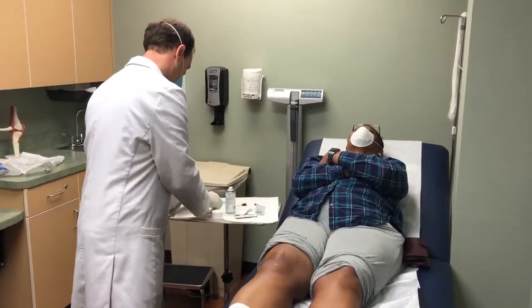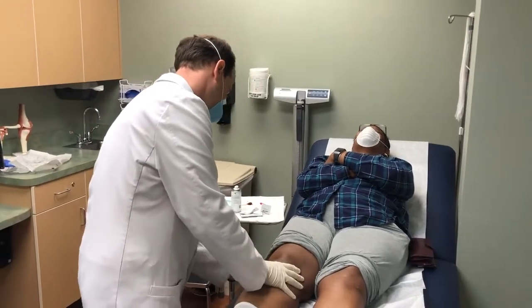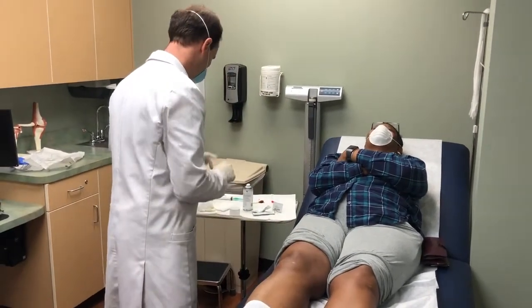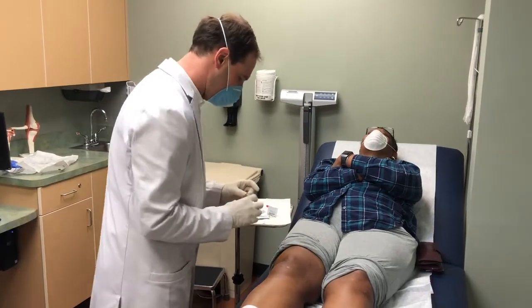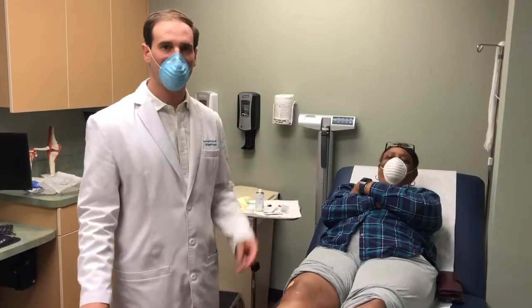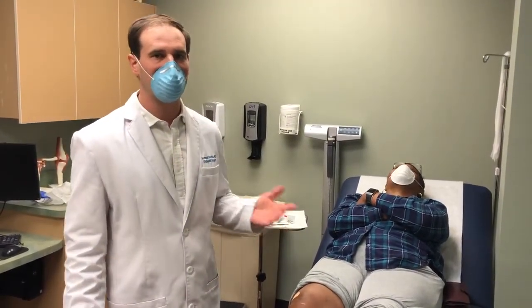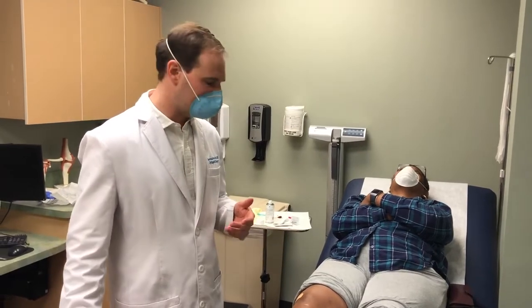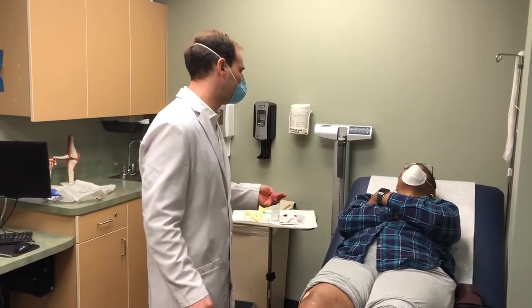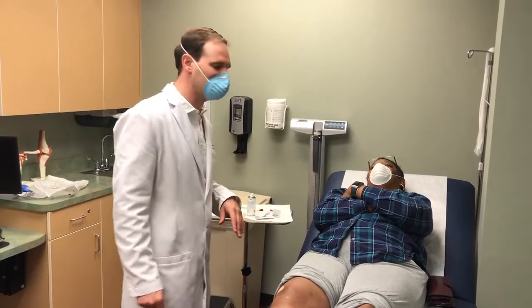We clean off the area and put on a band-aid. Even though there's no bleeding, it's really not a very traumatic process. The lidocaine will help initially but can wear off, and the steroid doesn't reach maximal effect until about two to three days. Be sure to ice the knee two or three times a day.